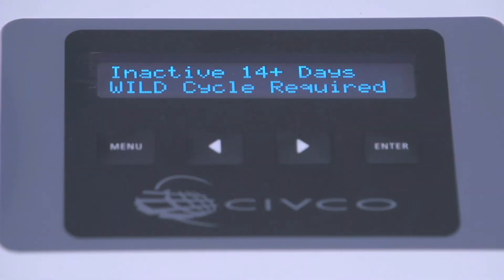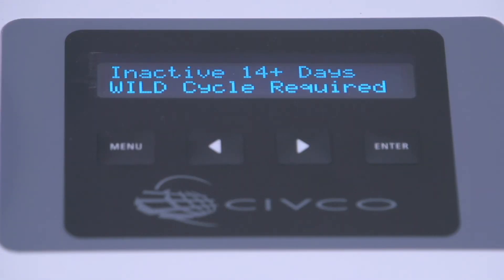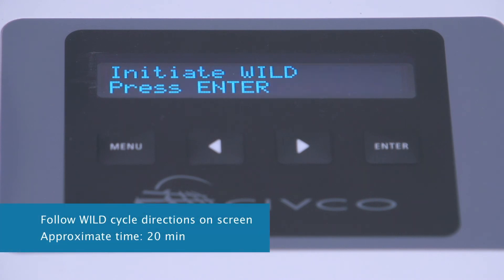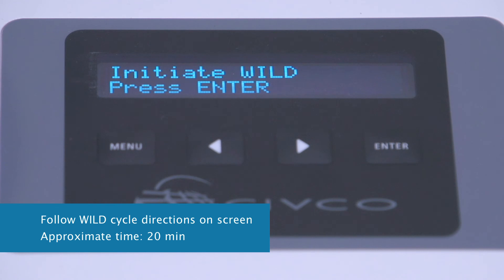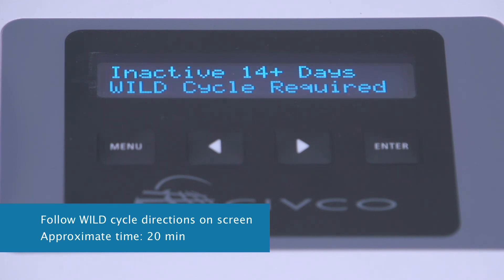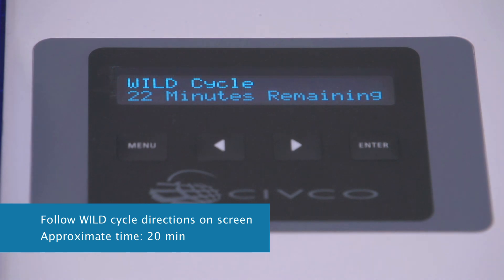The screen now says 'Initiate Wild Cycle.' A wild cycle is required every time a water filter is changed — it disinfects the water lines and the water filter. Simply follow the directions on the screen. This takes about 20 minutes, and the display will direct you once the water filter change is finished.